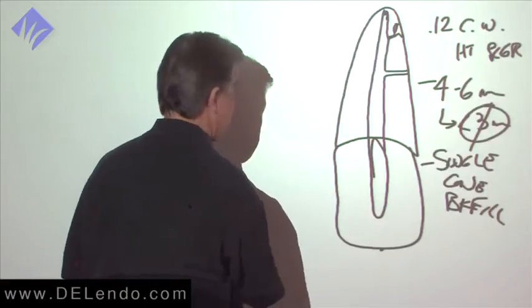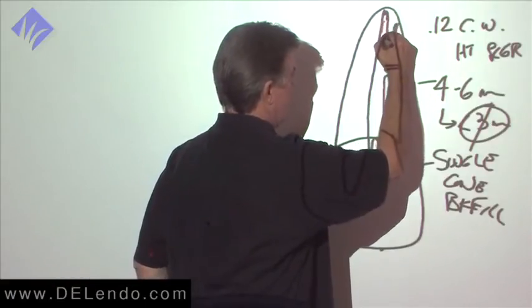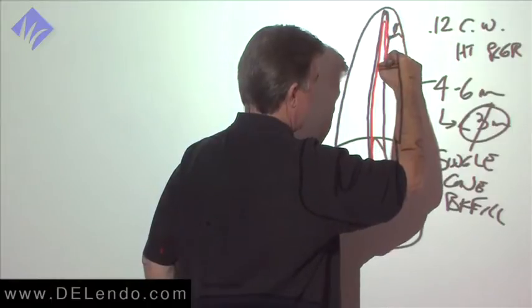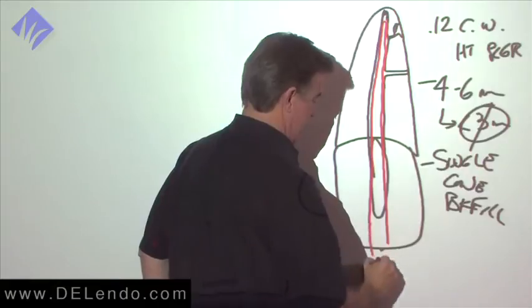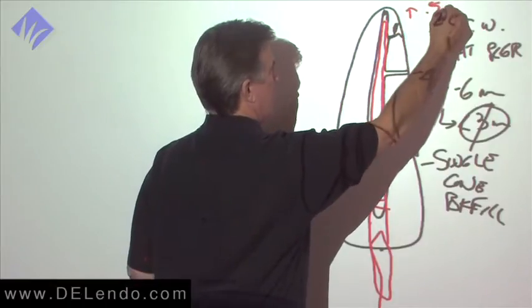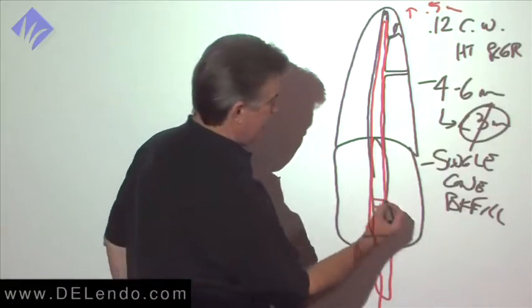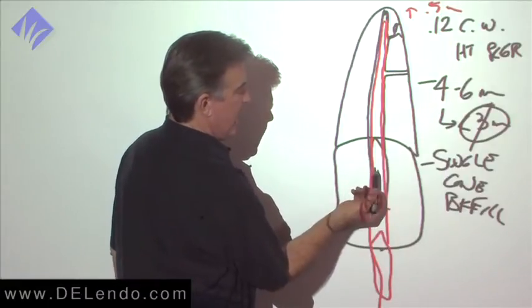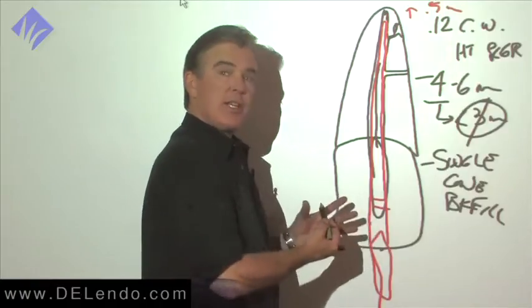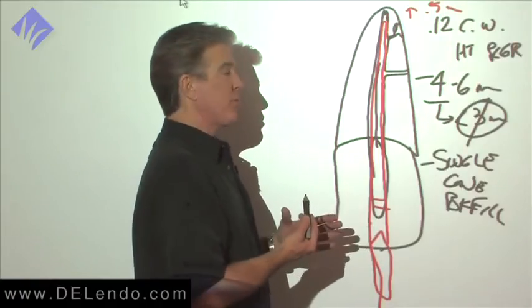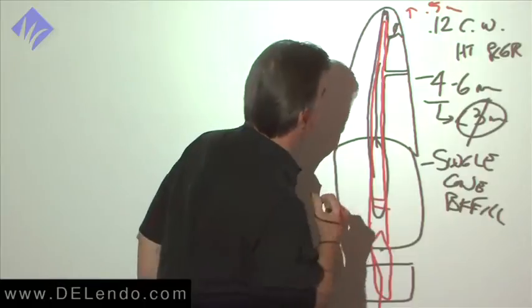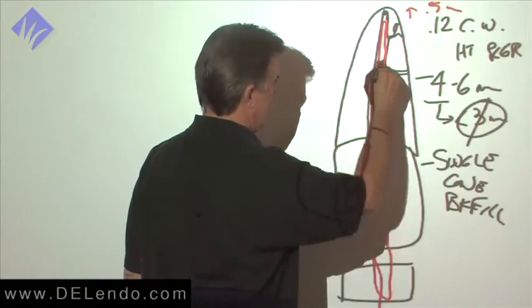The cone is cemented in place, and it's been fit one half millimeter from length, because during the obturation process, it's going to scoot a half a millimeter during the down pack phase. We take the plugger, and we insert it alongside the cone, and hit the button and drive down through it. As the plugger gets near its binding point, we're going to let our finger off the button. And as I'm down packing, I'm watching the stop on the plugger getting close to the reference point. When the stop on the plugger gets a millimeter away from its binding point, I'm going to let my finger off the button and continue pushing.